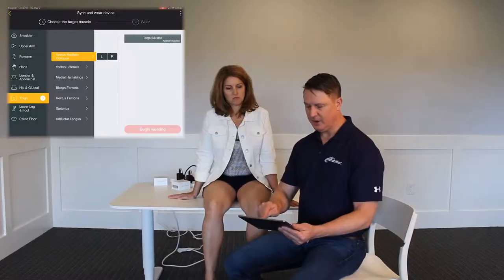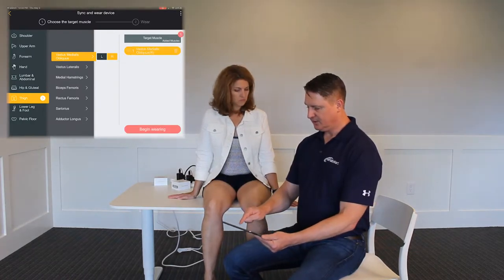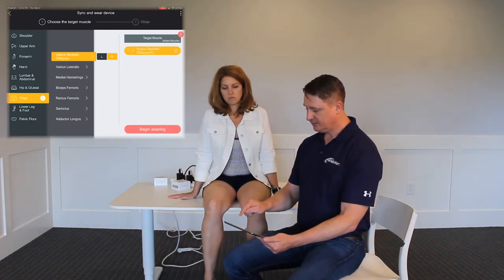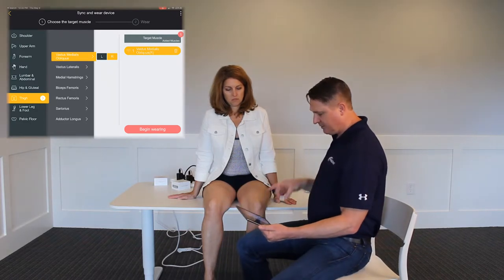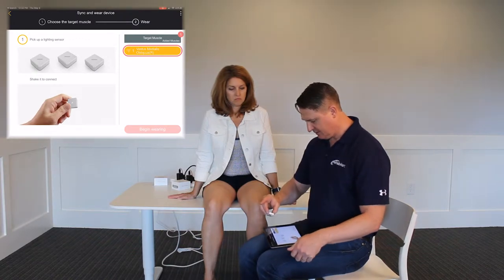We're actually going to be doing just the right leg in this session, so I'm going to choose right. I'm going to then click vastus medialis right. It's going to ask me to begin wearing — I want to shake the electrode to begin wearing and connect it.